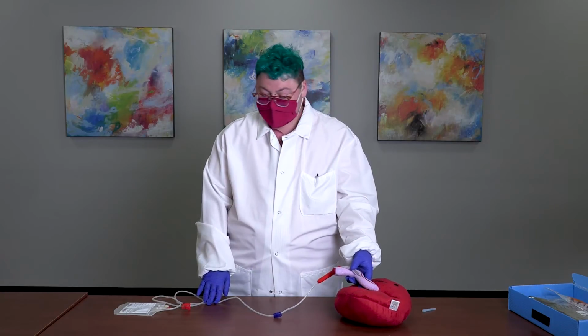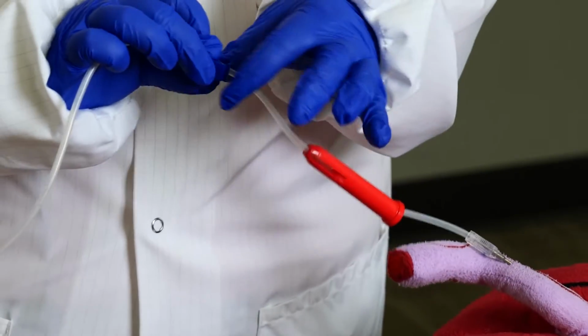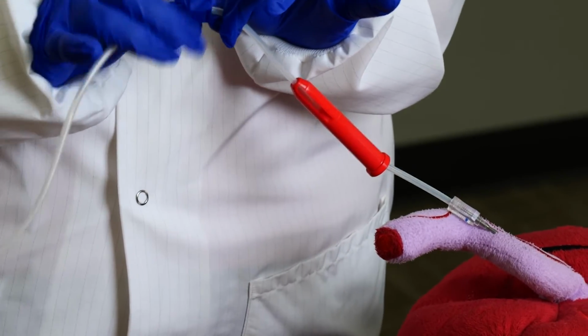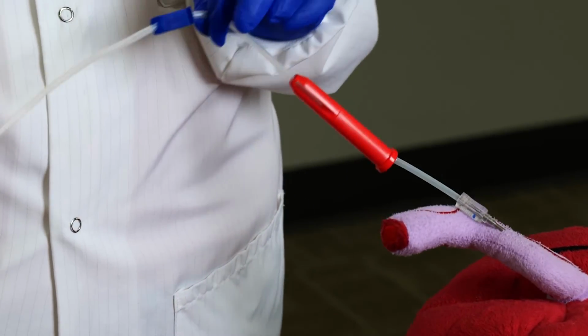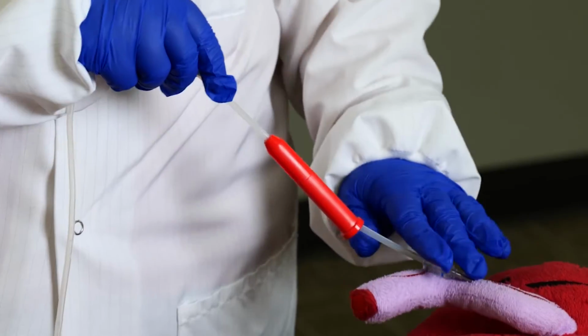Once you're ready to complete the collection, go ahead and clamp the blue clamp again. This will prevent any of the blood from exiting the bag, and it'll also prevent any air from getting into the collection bag and contaminating your donation.